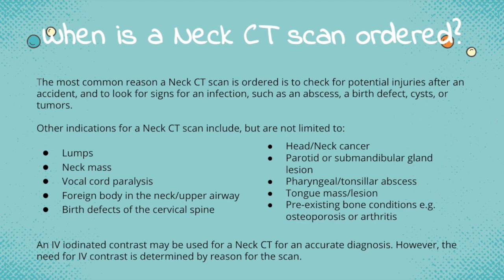Other indications for a neck CT scan include, but are not limited to, lumps, neck mass, vocal cord paralysis, foreign body in the neck or upper airway, birth defects of the cervical spine, head or neck cancer, parotid or submandibular gland lesion, pharyngeal or tonsillar abscess, tongue mass or lesion, or pre-existing bone conditions such as osteoporosis and arthritis. For a usual neck CT, an IV iodinated contrast may be used for an accurate diagnosis. However, the need for the IV contrast is determined by the reason for the scan.